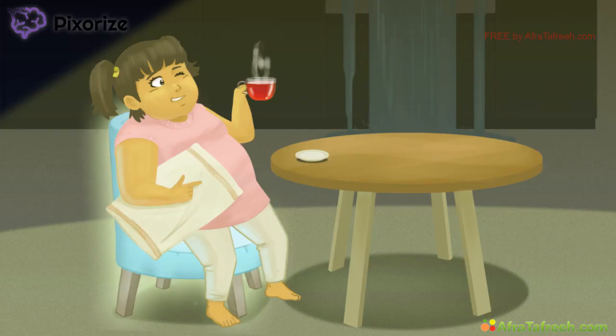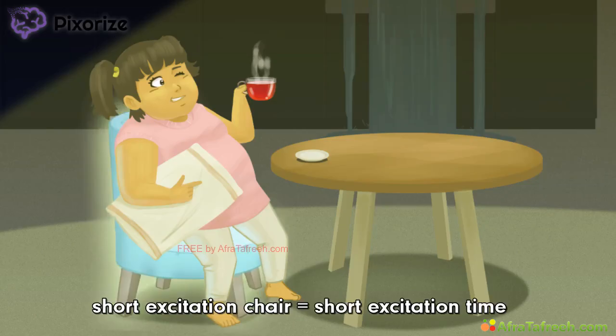Next, take a look at that chair she's sitting in. It kind of looks like it's glowing. Maybe it's heated? Who knows? Regardless, you can remember this as the excitation chair, and it's going to help you remember that the excitation time is short in T1. Don't worry if you don't think that this one is short now. Just wait until you see the T2 chair.